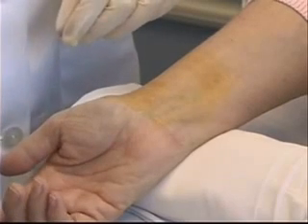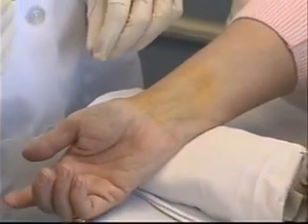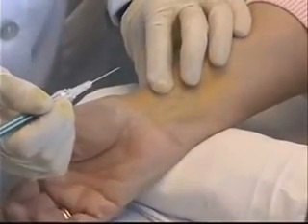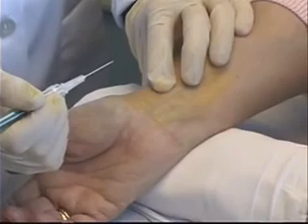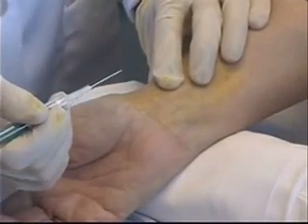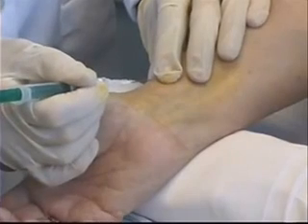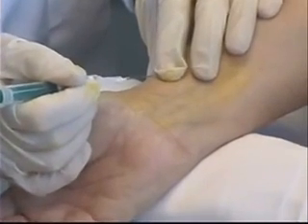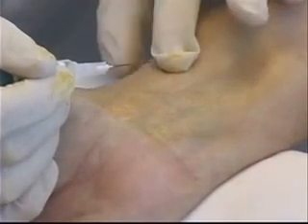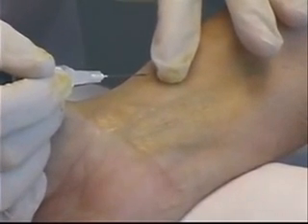I'm going to hold the syringe a little differently for the blood gas procedure — at a sharper angle, closer to 45 degrees, holding it much like a dart or a pen. I'll feel for that pulse, which is my only landmark for knowing where to break the skin with this needle. I've got my needle right there and I'm ready to go in. The last thing I do before going through the skin is roll my finger back a little bit out of the way, and then I put the needle into the skin.